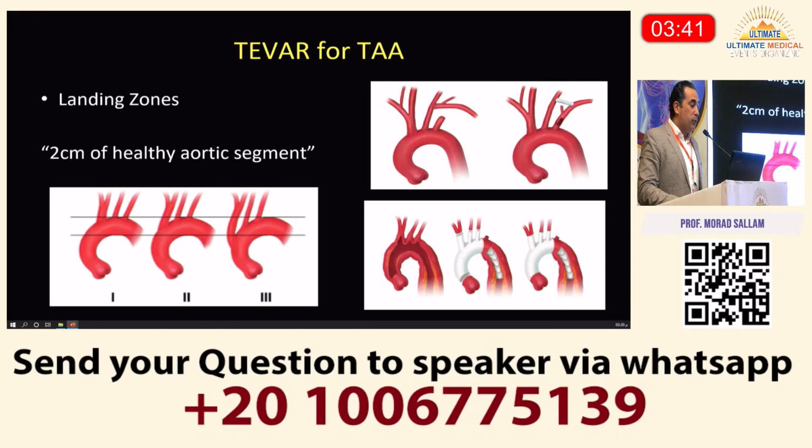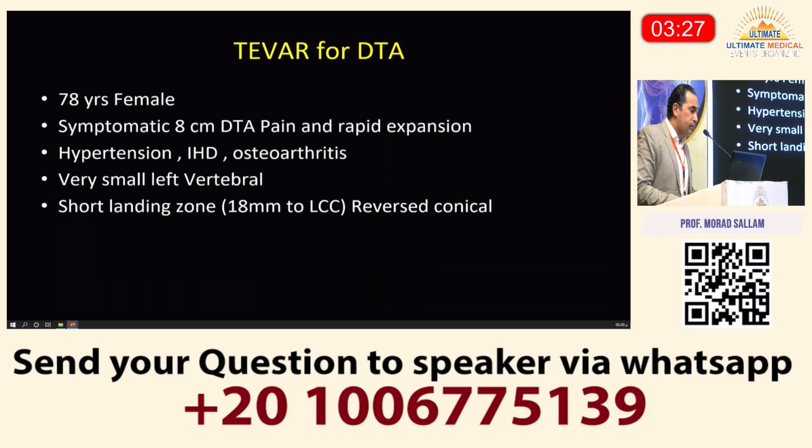So the TEVAR for thoracic aortic aneurysm with a 2 centimeter healthy segment of the aorta, you can extend that by some of the neck debranching, or you can create a frozen elephant trunk, or you can land in a total arch repair. All of these are ways to achieve a better landing zone. Now, this is a lady who is 78 years old, came with a symptomatic 8 centimeter aneurysm with pain, rapid expansion.